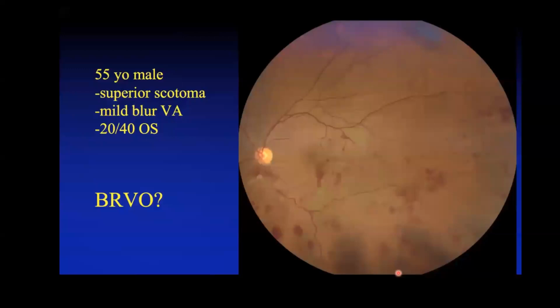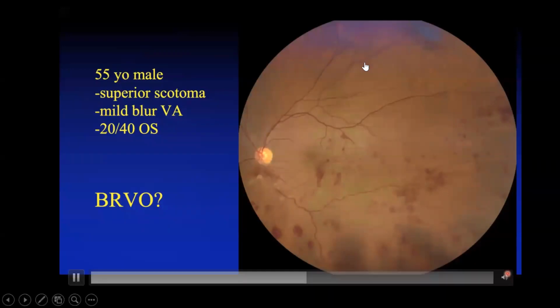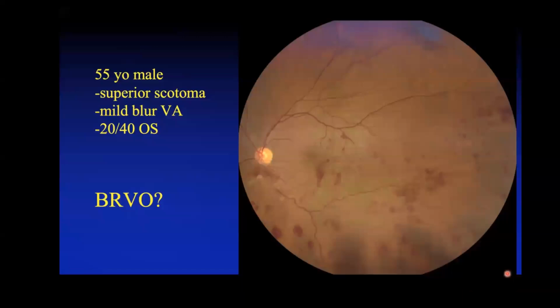There's hemorrhages that are flame-shaped, and also intraretinal hemorrhages along the infratemporal arcade. There's some cotton wool spots inferior to the optic nerve. We can see some sclerotic veins here, here, and as well as here along the infratemporal arcade. But there are a couple atypical features, and one is that the hemorrhages extend above the horizontal raphe. There are some irregular loopy blood vessels here, and there's also AV nicking superior to the optic nerve. So is this consistent with a branch retinal vein occlusion?